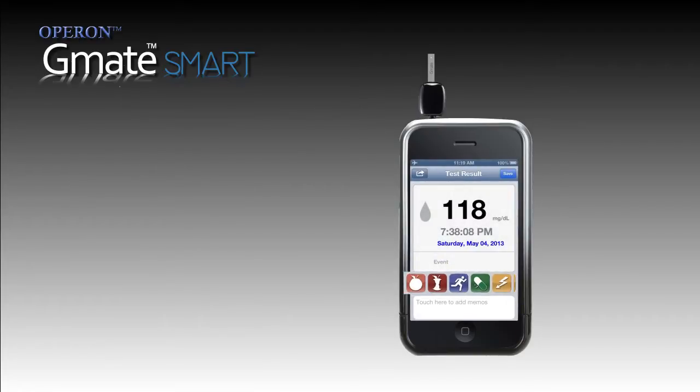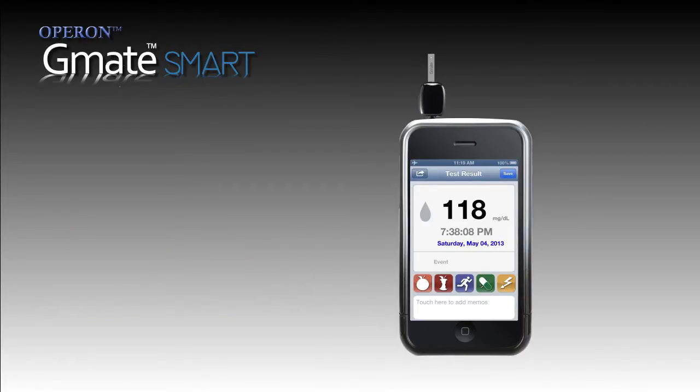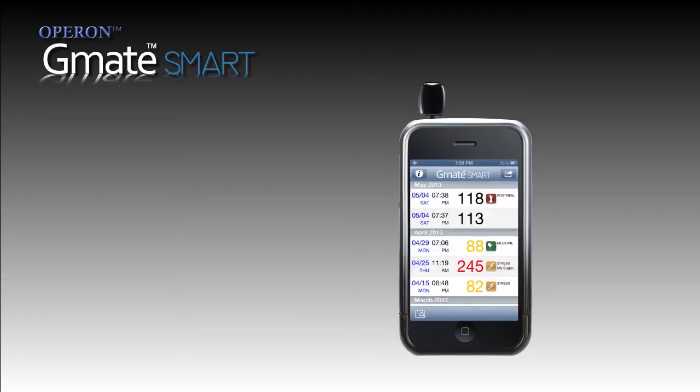Label the value as appropriate. Five types of indicators are available for you to select from: pre-meal, post-meal, exercise, medication, and stress. If it's something other than this, you have an option to add your own remarks. Press done after completion and save the record.